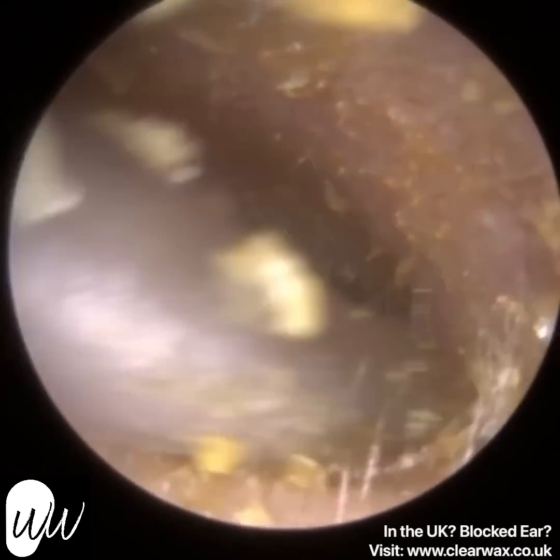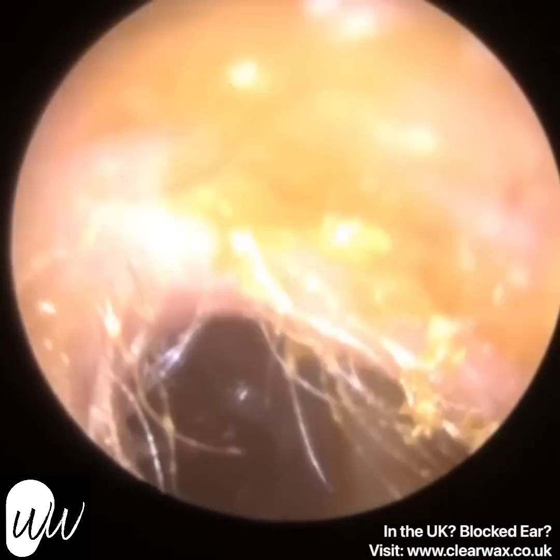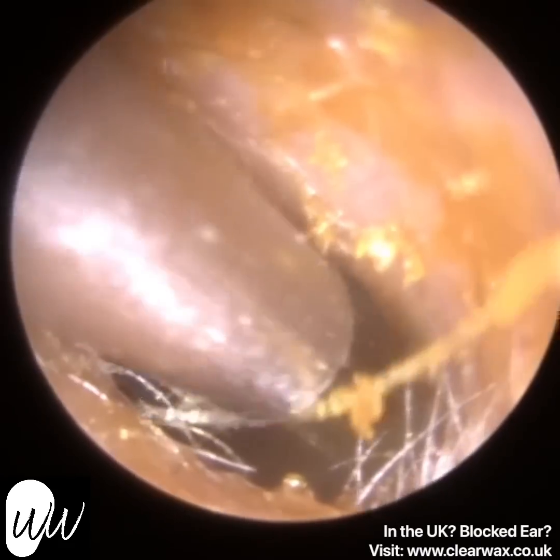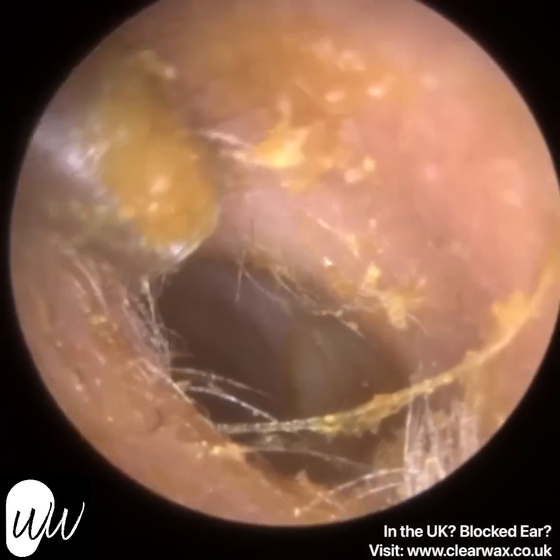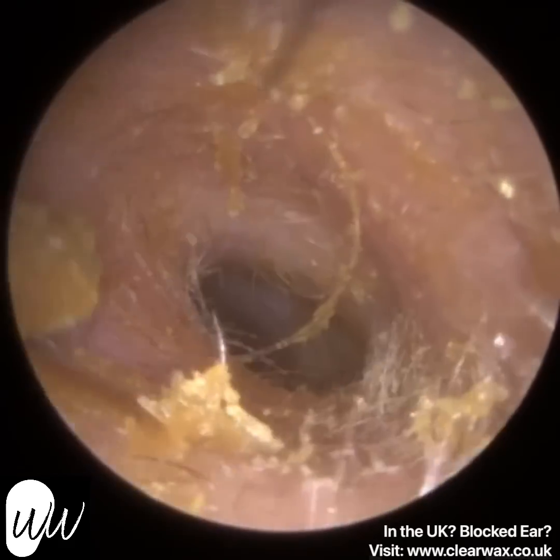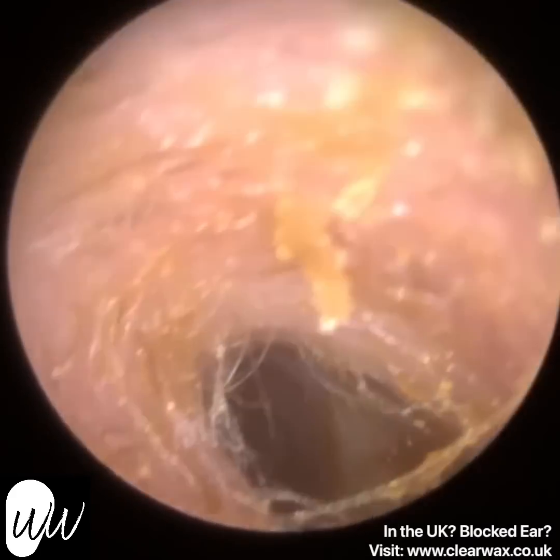It's purely their left. Sometimes that happens when you've got an ear infection of both ears, or just even with simple earwax. If you've got an earwax infection of both ears, if one's worse in the ear, the patients typically just notice the worst ear. They think the better ear is actually absolutely normal, because they're using their bad ear as a reference point. And it's only once you've cleaned the worst ear and the patients then think, oh, I can't also hear from my bad ear. You can just have a perspective there how narrow this entrance is.